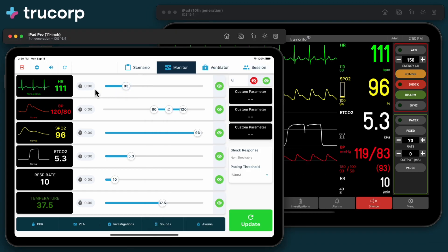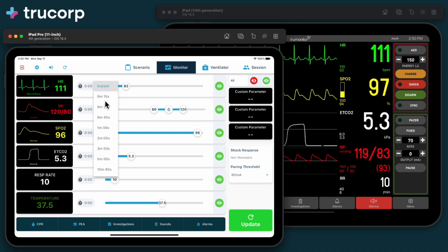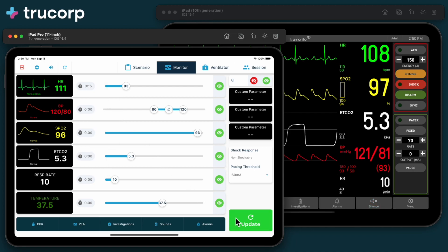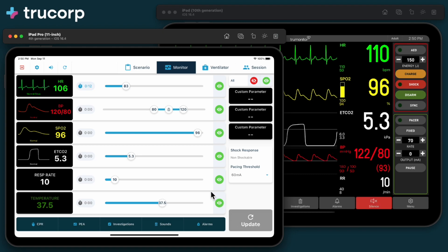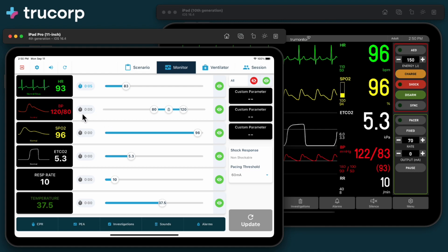Use the timer button to make changes over a selected duration. When the update button is pressed, the heart rate will be reduced over a period of 15 seconds. You can select a change period of up to 10 minutes, and the vitals change automatically over the selected time.